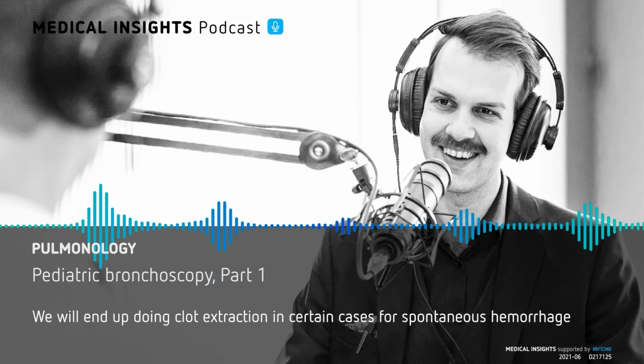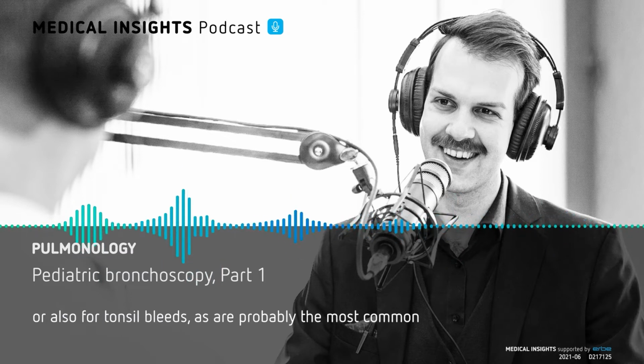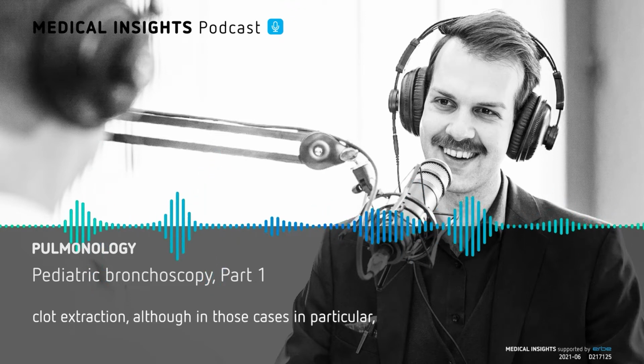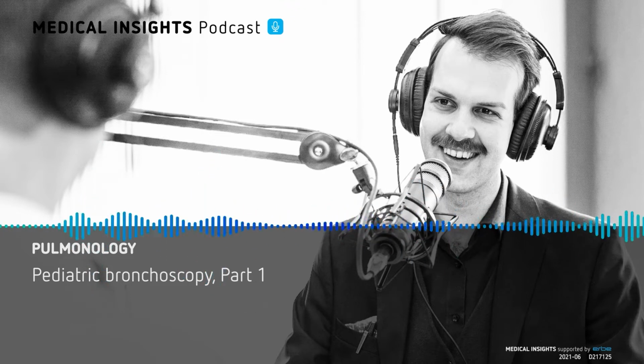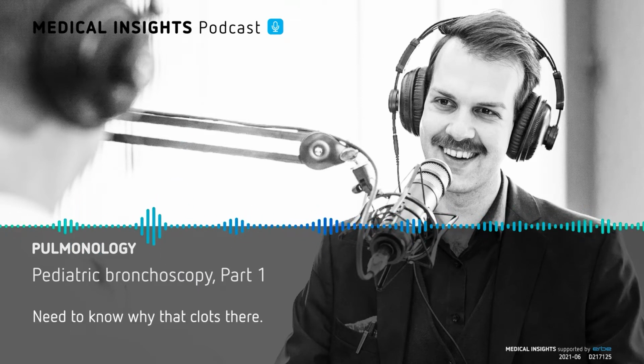We will end up doing clot extraction in certain cases for spontaneous hemorrhage, or also for tonsil bleeds. Those are probably the most common other things outside of ECMO where we've had to do clot extraction, although in those cases in particular, never mess with a clot unless you're prepared to deal with the consequences, and you need to know why that clot's there.